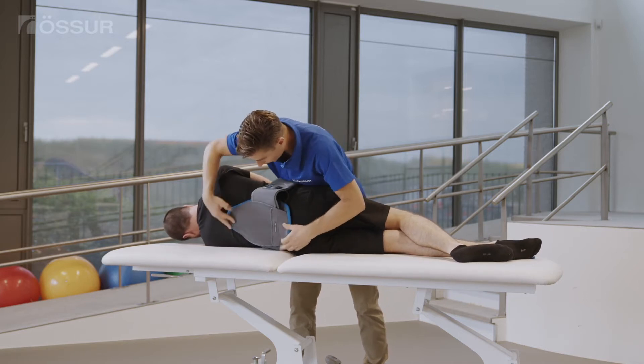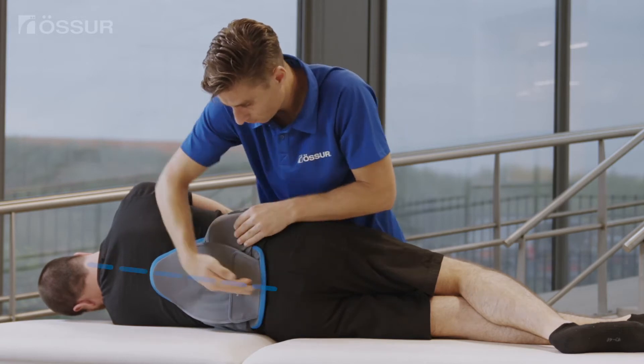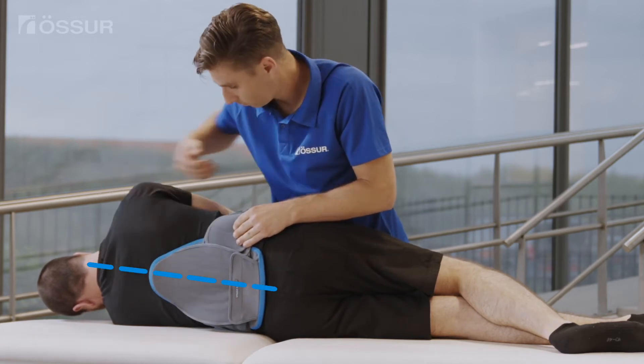Position the belt by centering the posterior panel over the spine with the bottom of the posterior panel approximately at the sacrococcygeal joint.